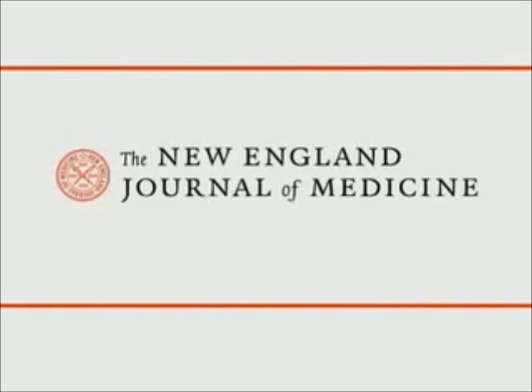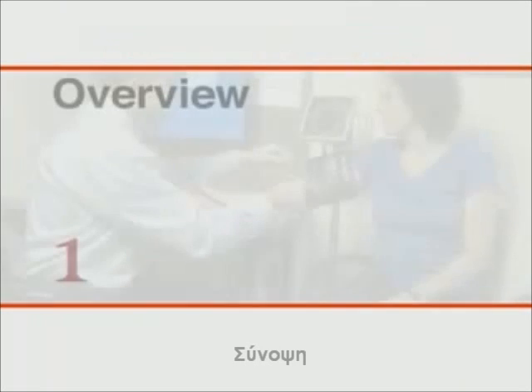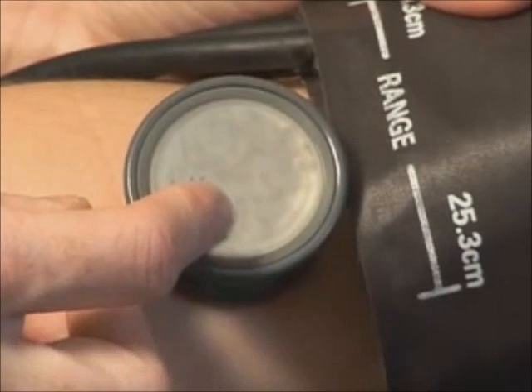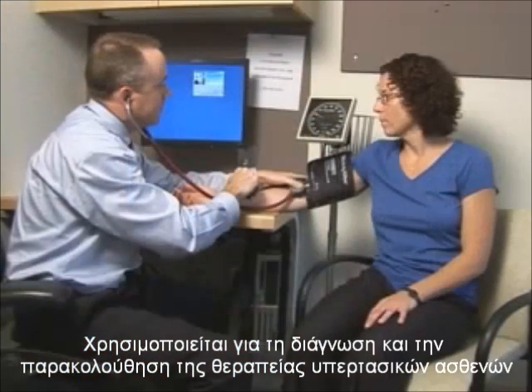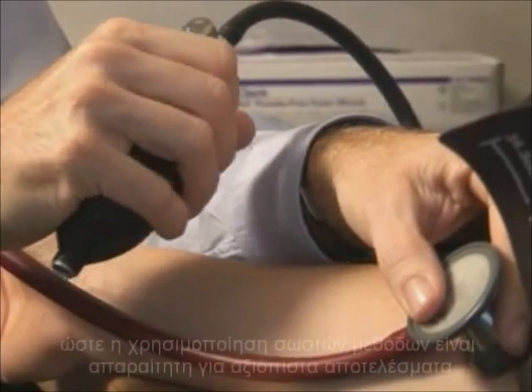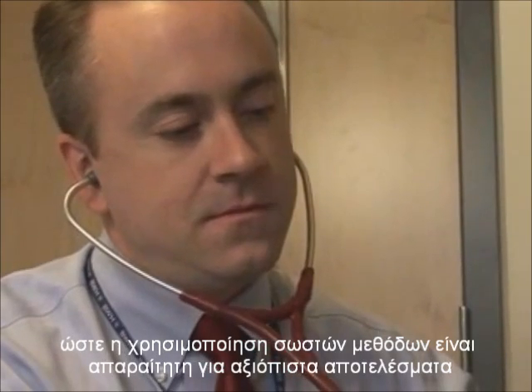This is a video in clinical medicine from the New England Journal of Medicine. Evaluation of blood pressure is essential in assessing cardiovascular health. It is used in screening for hypertension and for monitoring the effectiveness of treatment in patients with established hypertension. In the routine outpatient setting, blood pressure is measured indirectly. Thus, it is important that proper techniques be used in order to produce consistent and reliable readings.